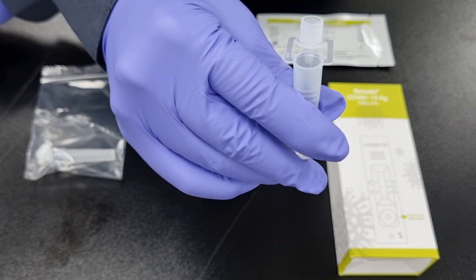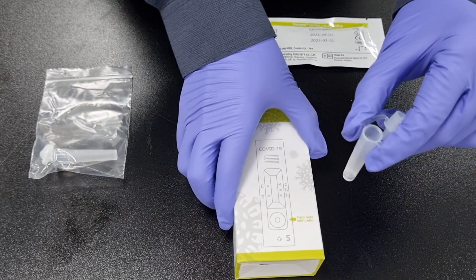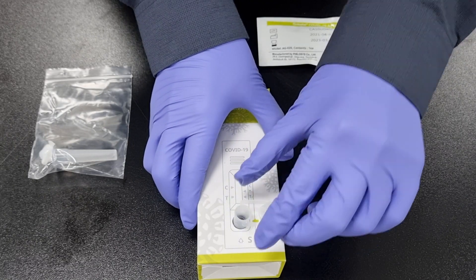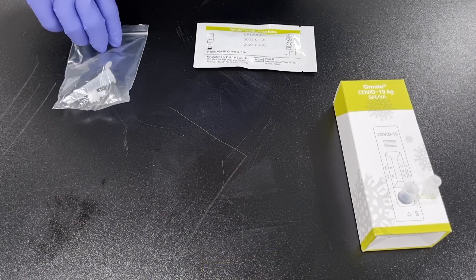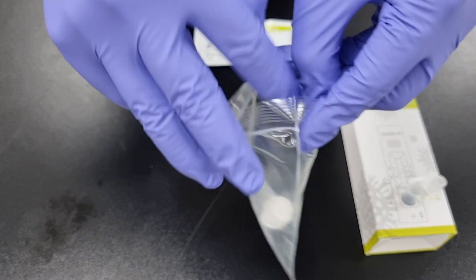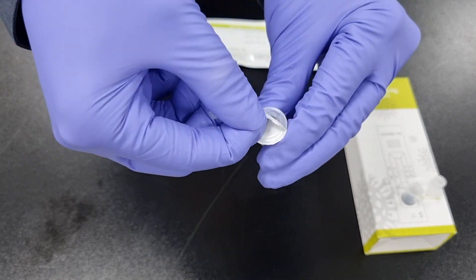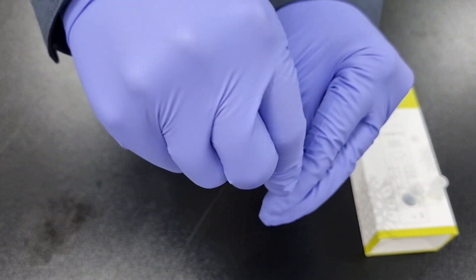Step 6: Remove the funnel and place the sample collection tube in the hole marked on the package box. Step 7: Take out the reagent tube and dropper cap. Remove the foil of the reagent tube and close it with the dropper cap.